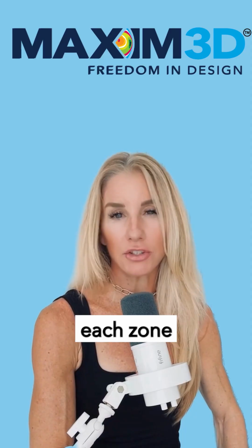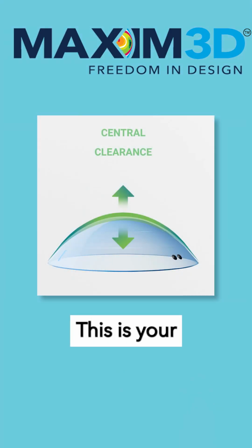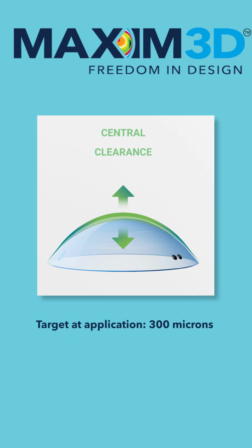Now let's assess each zone individually. Number 1, central clearance. This is your primary read once the lens is applied. This is our recommended target. At application, we suggest approximately 300 microns. After settling, 150 to 200 microns.